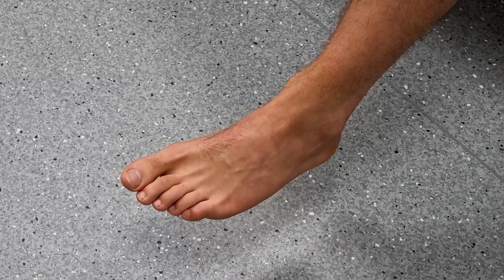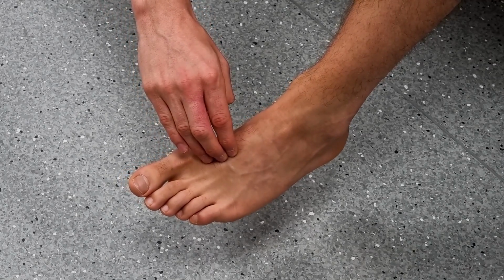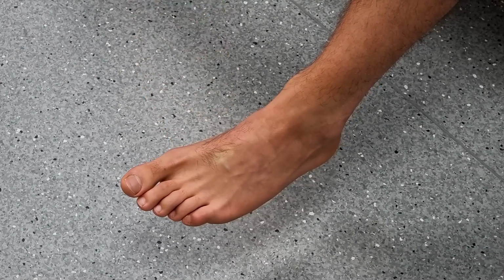The other major artery of the foot is the dorsalis pedis artery. To palpate this, locate the extensor hallucis longus tendon and palpate just laterally to it. This is important clinically when you assess a patient with peripheral vascular disease.